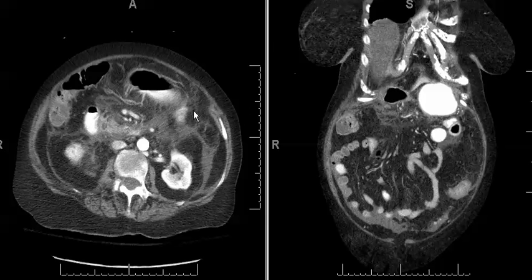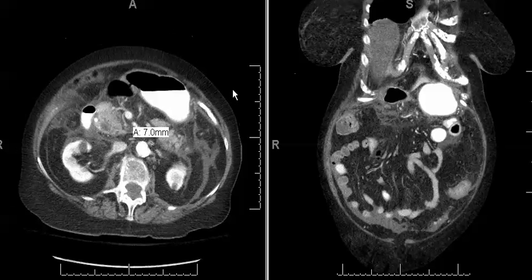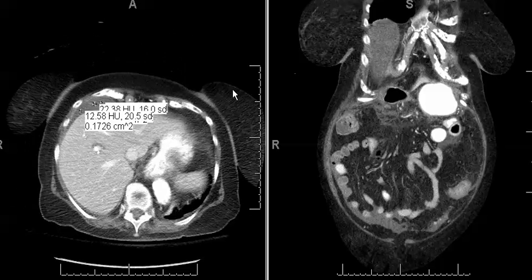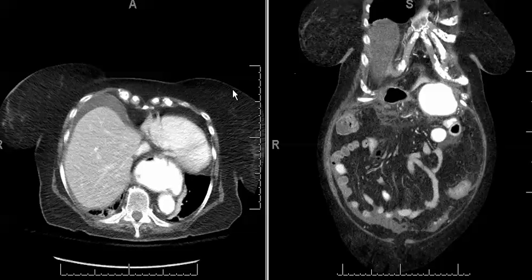Here we have axial and coronal CT images through the level of the abdomen and pelvis after the use of intravenous and oral contrast in an 85-year-old female presenting with abdominal pain, nausea, and vomiting.